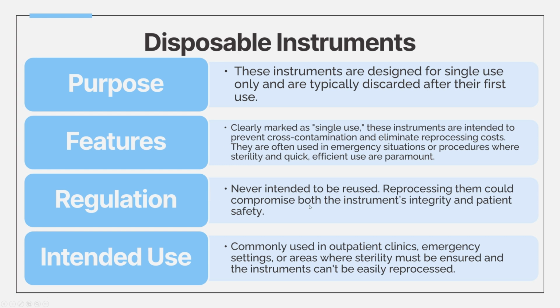They are not for reuse. Reprocessing compromises integrity and safety for the patient. And they are more common in outpatient clinics, emergency settings, and areas requiring guaranteed sterility, but that needs to be in a fast-paced environment, right?